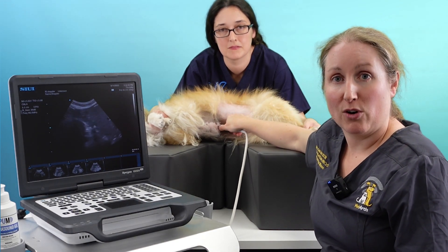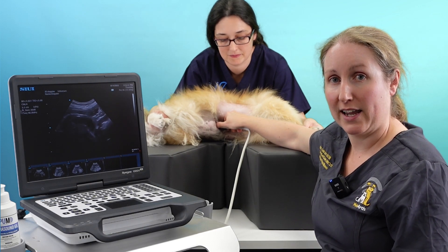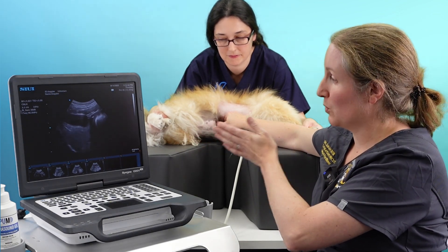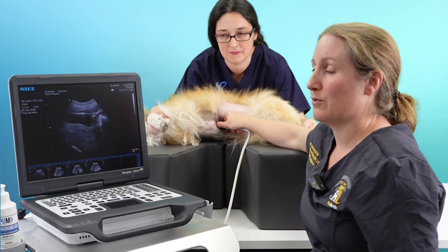When we start scanning the liver, we begin in a ventral position. In this position I'm scanning at an angle facing up towards her head, so that we are scanning towards her diaphragm, which we can see here, and her liver appears in view here.